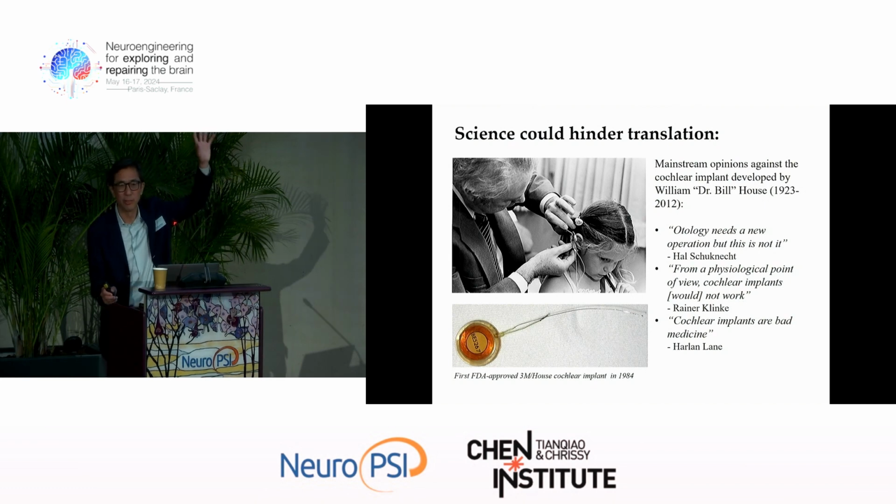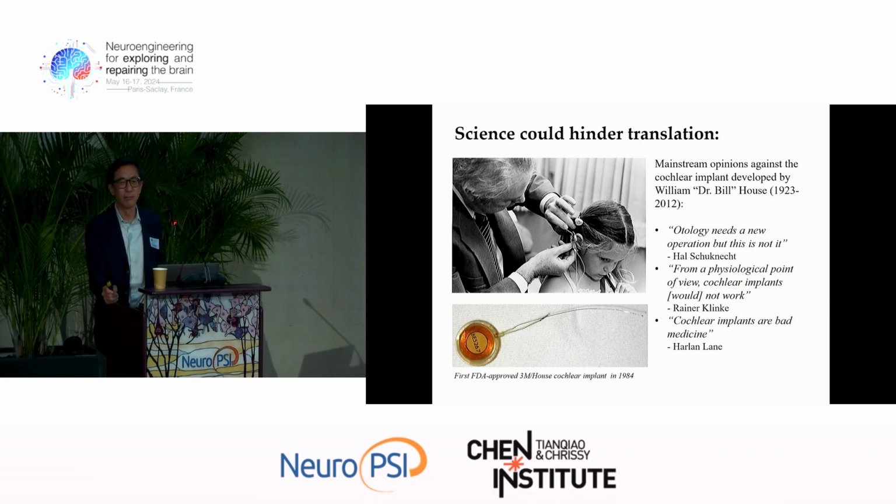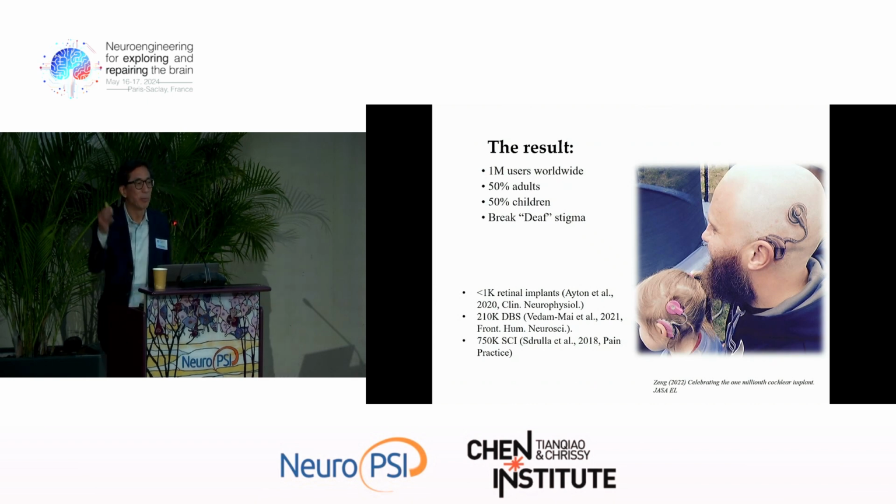And there were other people from the deaf community, linguists, who jumped on Bill House, right? He was the guy who stood there by himself against the opposition from the authorities in the field. They said it's not going to work, right? And it took him a lot of courage to develop this device. And I'll show you, of course, there are limitations with that single channel device. But somebody else said, if we can put in 1, maybe we can put in 2, 3, 4, and people put in 20 or so electrodes into the inner ear.